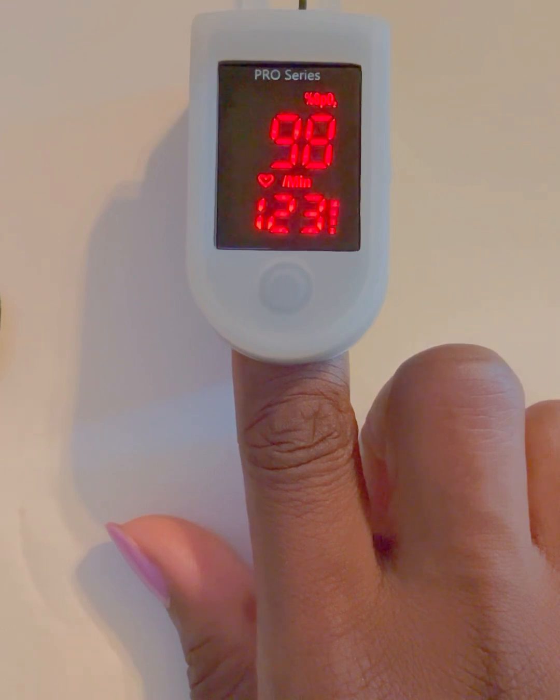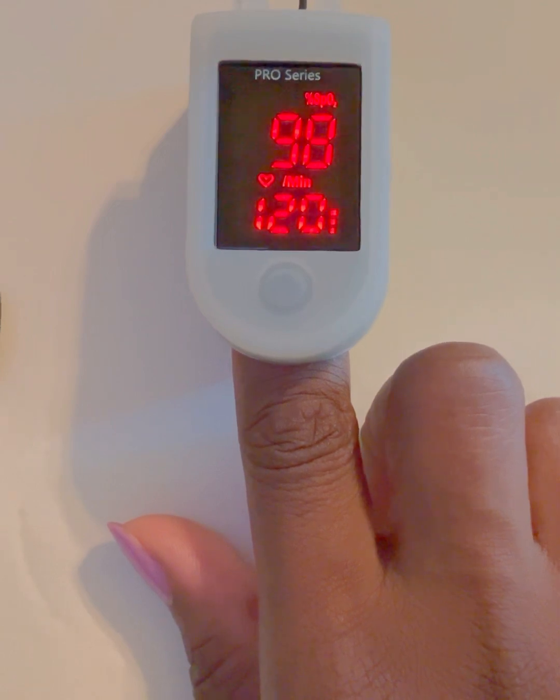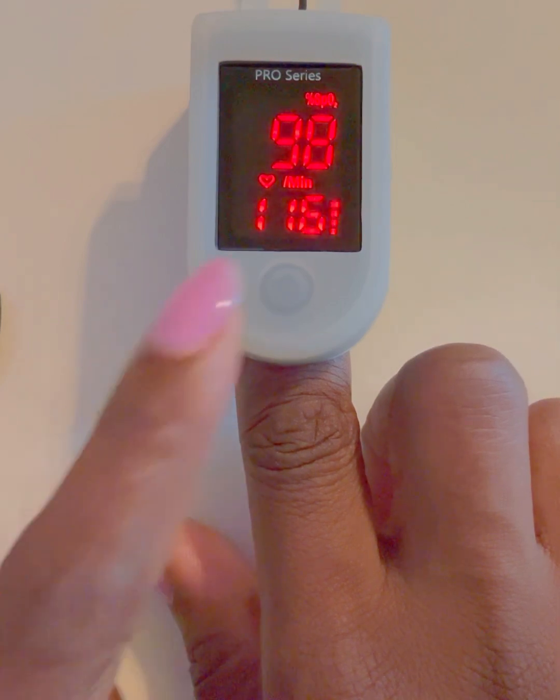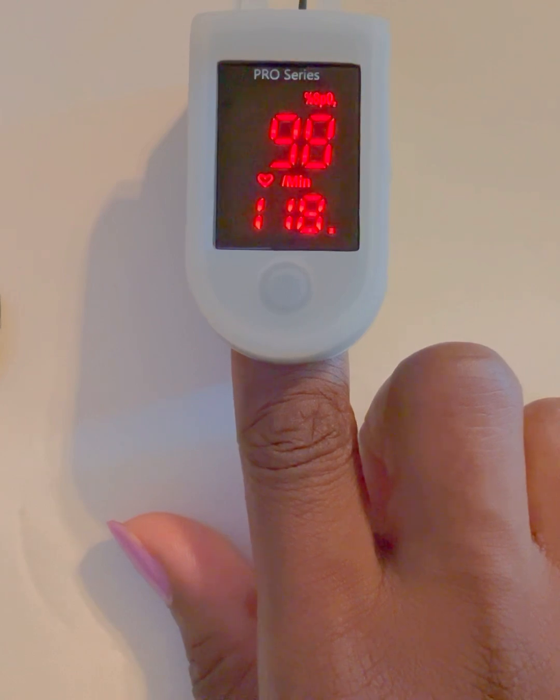There are some things that could affect how accurately the reading is presented. You'll want to make sure that you wash your hands. Keep in mind that certain nail polish can interfere with the sensor and provide a false reading — I do have nail polish on right now, so that could possibly indicate a false reading for my heart rate. But for demonstration purposes we're going to continue with this.